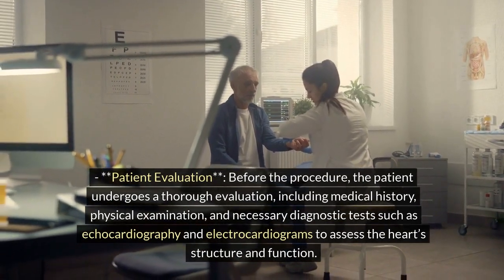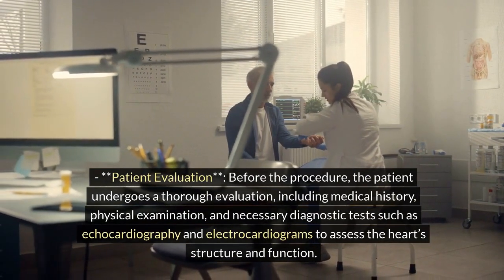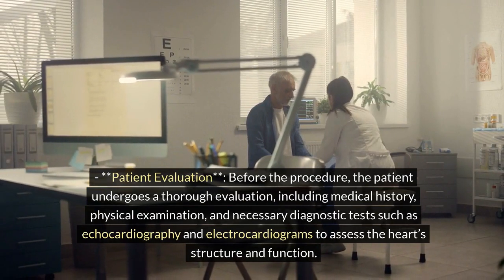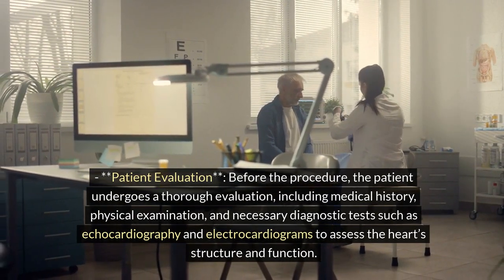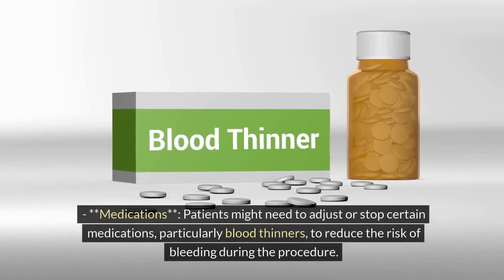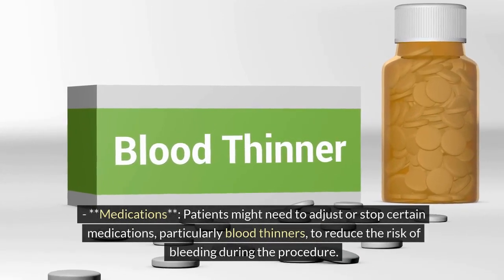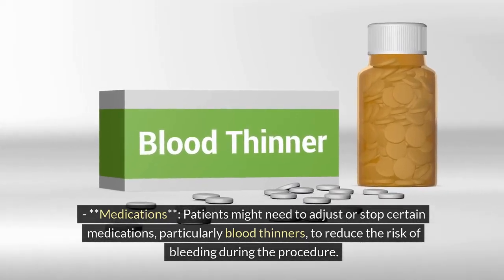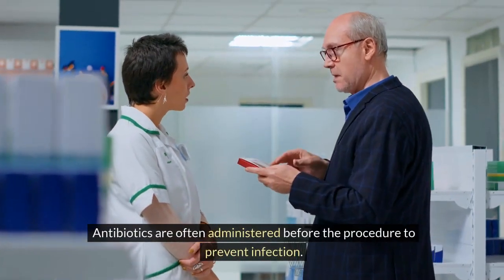Step 1: Pre-procedure preparation. Patient evaluation: before the procedure, the patient undergoes a thorough evaluation including medical history, physical examination, and necessary diagnostic tests such as echocardiography and electrocardiograms to assess the heart structure and function. Medications: patients might need to adjust or stop certain medications, particularly blood thinners, to reduce the risk of bleeding during the procedure.